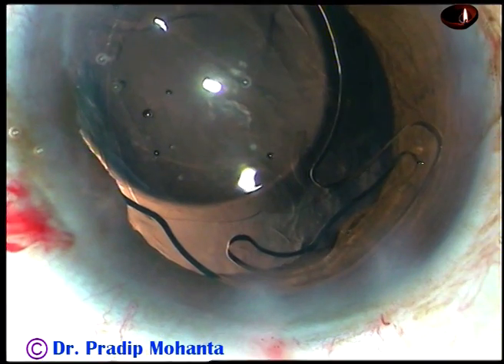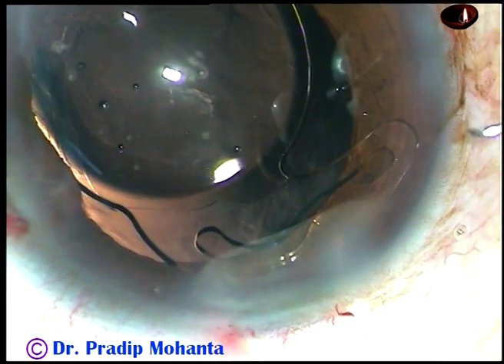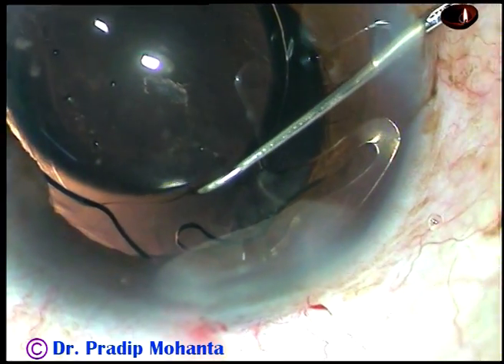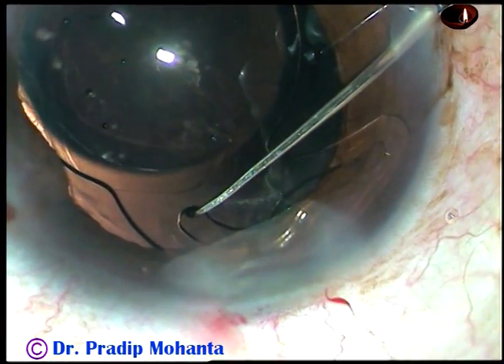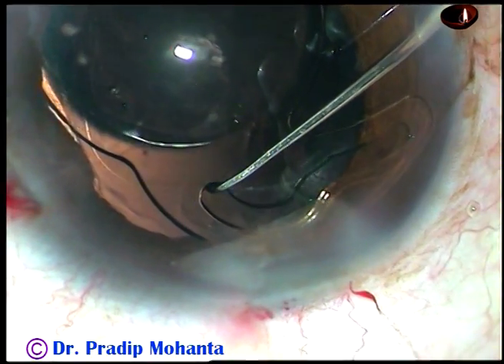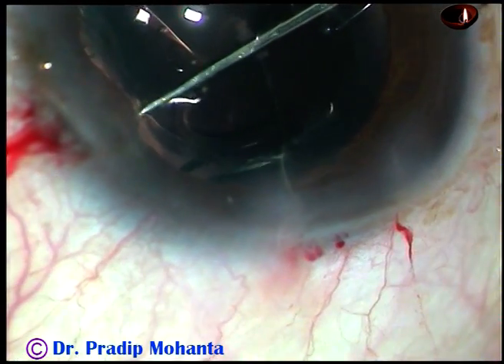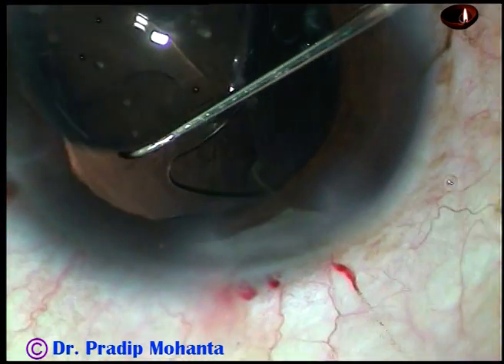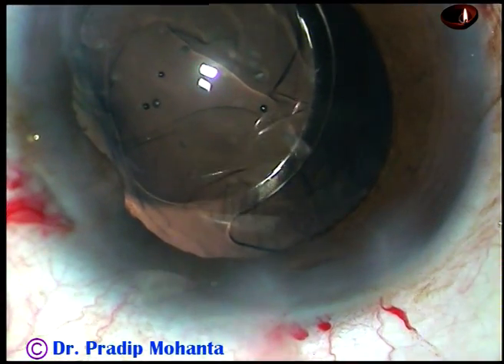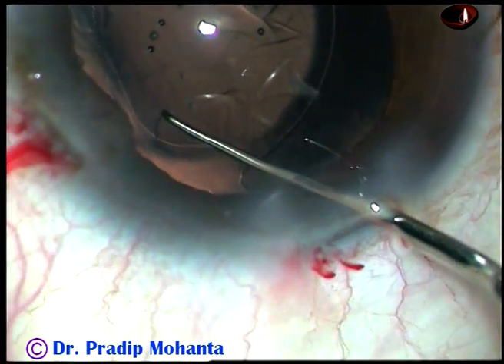Now take a Sinskey hook and go through the right side port. There is a gap in the haptic — pull the haptic towards the center of the anterior chamber and depress it backward so that it goes into the capsular bag. Thus you can put the haptics into the capsular bag.